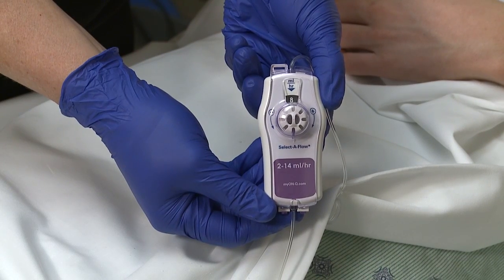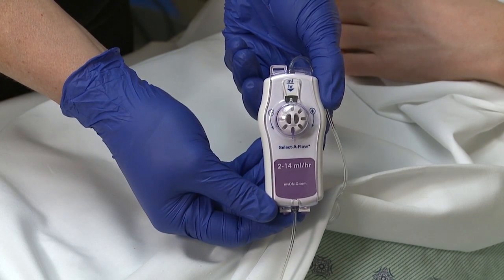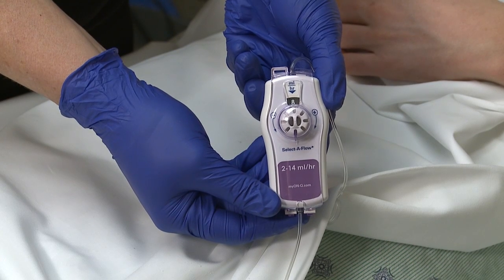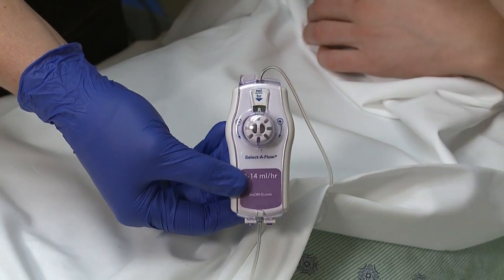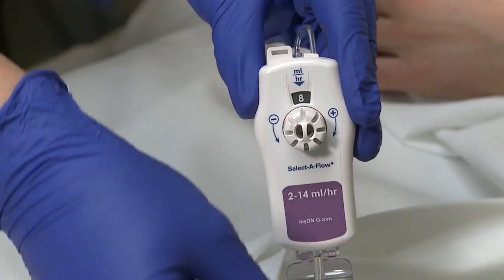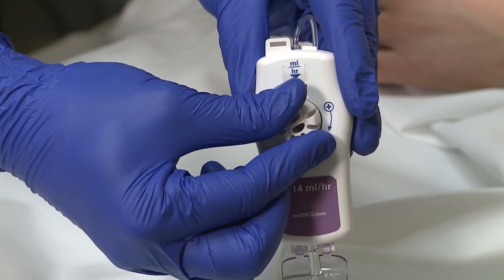If you feel too numb, turn it down. If it's not enough, turn it up. Just remember two things. First, it is infusing a long-acting local anesthetic, so the effect of changing the rate can take time, maybe an hour or more. So if you're hurting and you need more numbness, the squeeze button will be faster. With the button, you usually will feel better within 10 to 20 minutes. The other thing to remember is the higher you keep the rate, the faster the pump will run out. But use what you need to use so that you're not suffering.